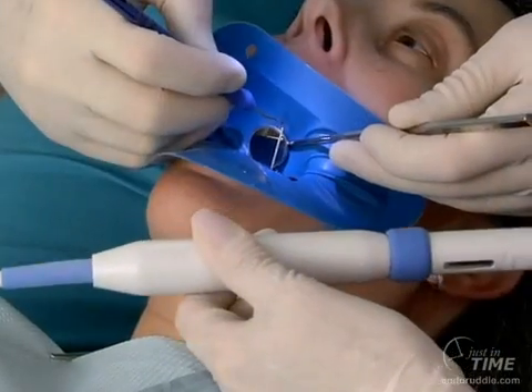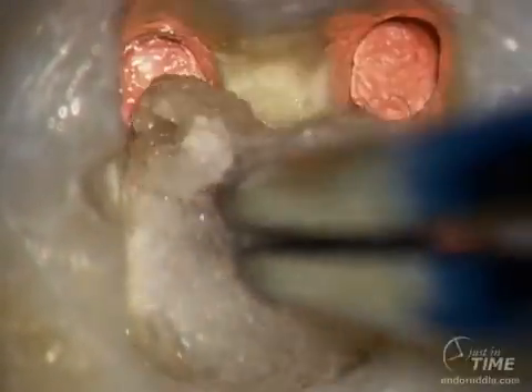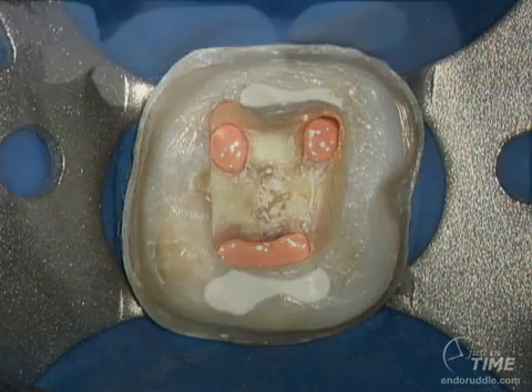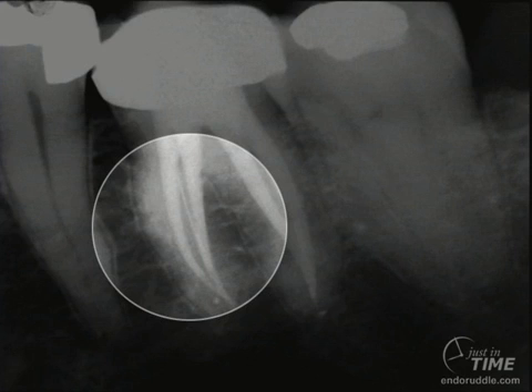Again, backpacking to about 2mm below the orifice. At the conclusion of the backpack, a pledget with chloroform is used to remove residual sealer remnants and gutta percha, and we do this until the chamber is nice and clean. We follow that with 70% isopropyl alcohol, so adhesion dentistry can ensue, even using a eugenol-based sealer. If we look at the postoperative film, you can see the denseness of the pack, the deep bifidity, and the anastomosing between the MV and ML systems.